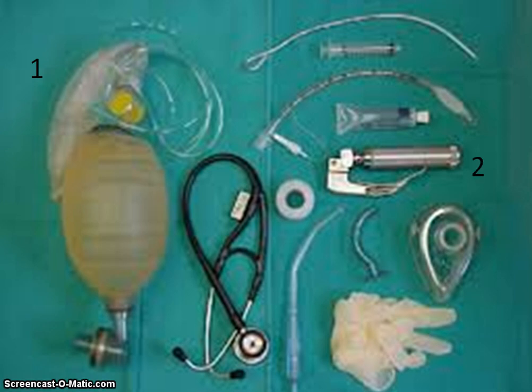We also need a working laryngoscope with a blade, usually a Macintosh blade for adults, some gel for lubrication, a syringe to pump air into the cuff, an ET tube, a stylet or introducer, some tie to stabilize the endotracheal tube after it is in place, a stethoscope, a suction with rigid Yankauer, and last but not least some gloves. An oropharyngeal airway can also help you in the process of intubation.